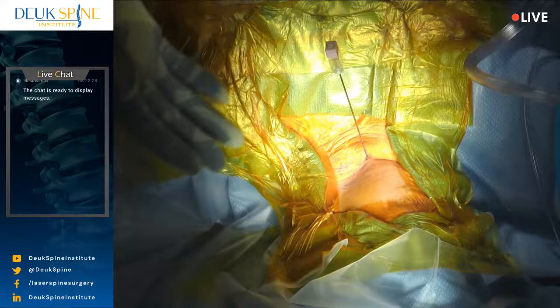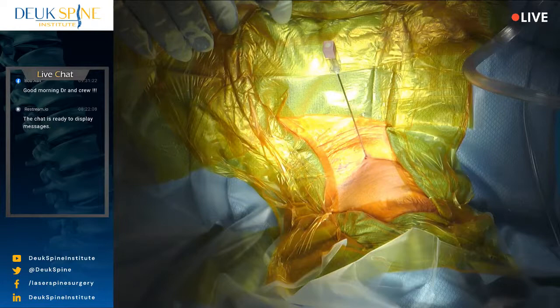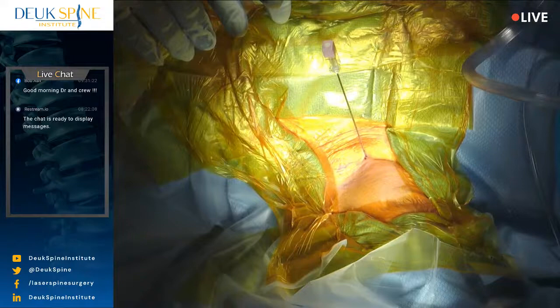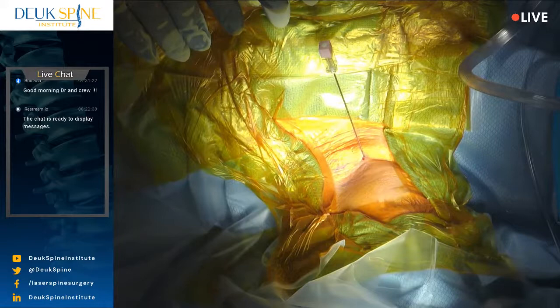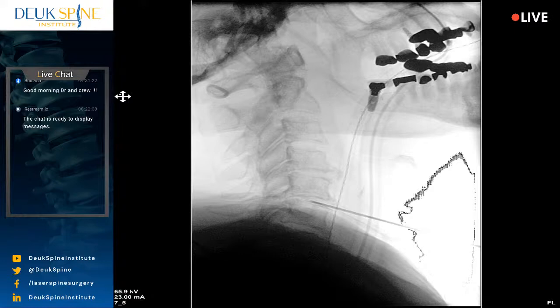Now I went right between two muscles in the front of the spine called the longus colli muscles. If my fingers represent the longus colli muscles, there's a left and a right longus colli muscle. Go ahead and put something between my fingers, the dilator. So we went basically right into the disc between those two muscles. You see that, Zach? Yeah. Now, if the needle goes into the longus colli muscle, you're going to get a little bit of bleeding, and you're also going to possibly hit the sympathetic trunk that's in there. Then you can get a Horner syndrome. So you want to avoid the longus colli muscles.